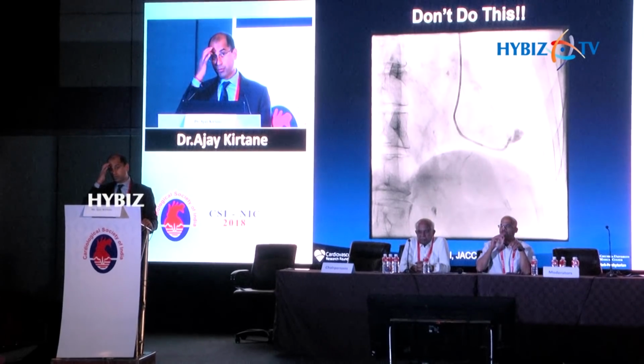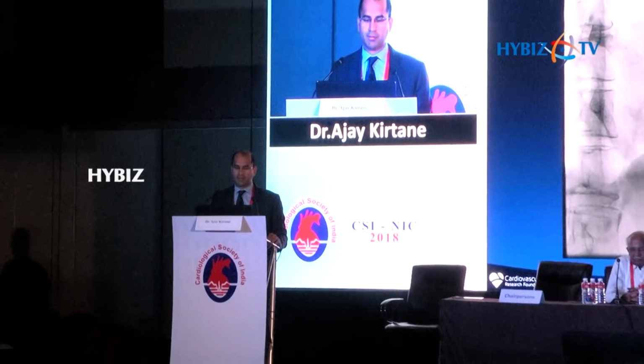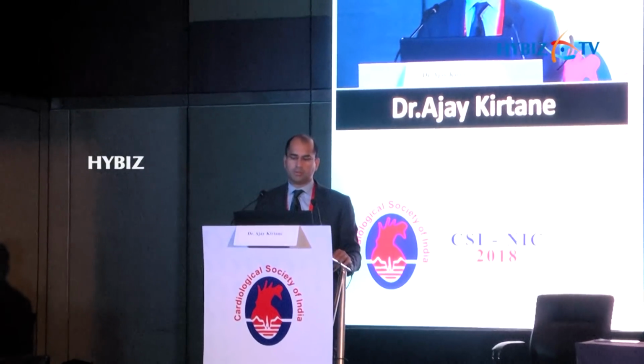You do not want to do this. This is an example of an end hole-ish type of catheter. Actually, this has even side holes, where it's basically injected, perforates through the wall, and you get into the pericardium, and then the operator pulls it back because they see what's going on.